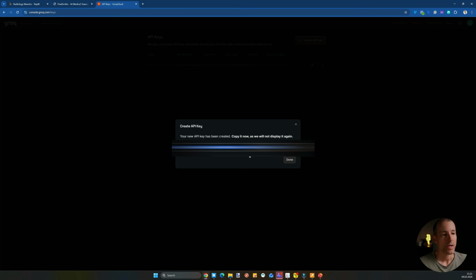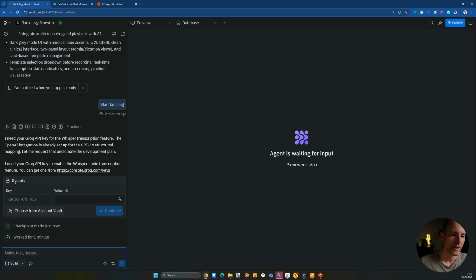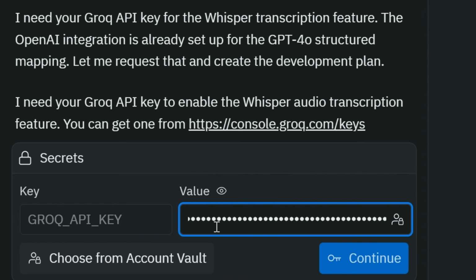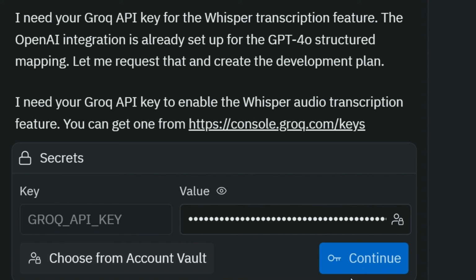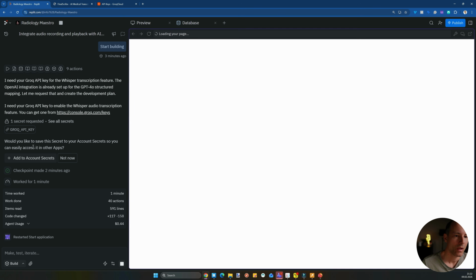Very important, don't share the key with other people because they can use your stuff. That's why it's blurred out. But I have this key now and we put this here in Replit into a secret. Secrets mean it's stored safely in your Replit account and nobody can use it. And it's not in the code, so if somebody hacks you in the code, they can't see it. Sometimes if people do vibe coding and they give the keys to the chat, it might actually reveal the keys. So you have to be a little bit careful here. I gave it the key now and it's saved to the platform. Let's see what's next.